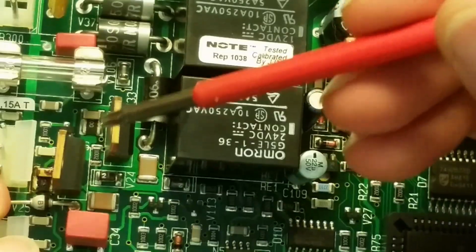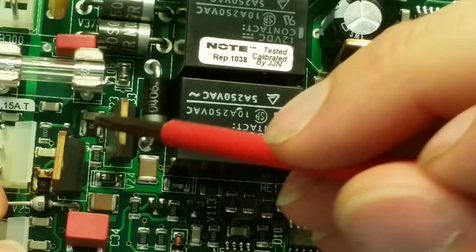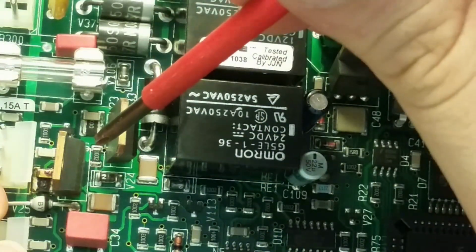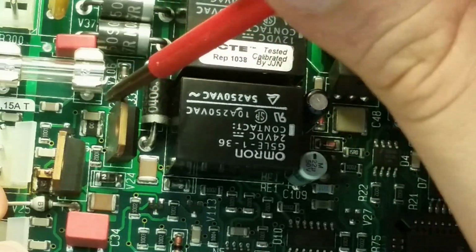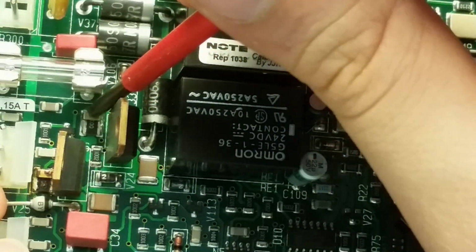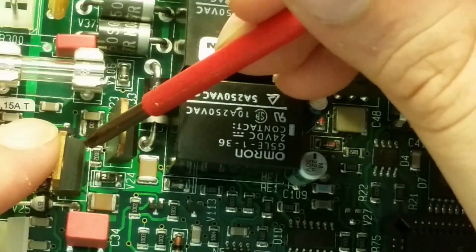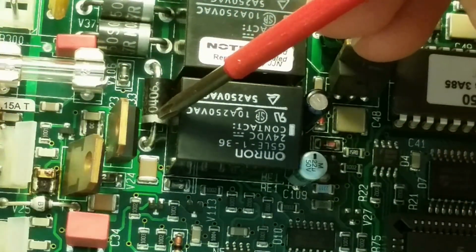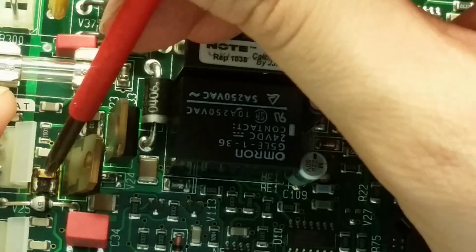And if you look down here near the transistors, we can see some pretty interesting component layout. Got a resistor underneath the capacitor here. So they soldered a capacitor directly on this resistor here instead of having it beside it. They maybe didn't have so much room for that.